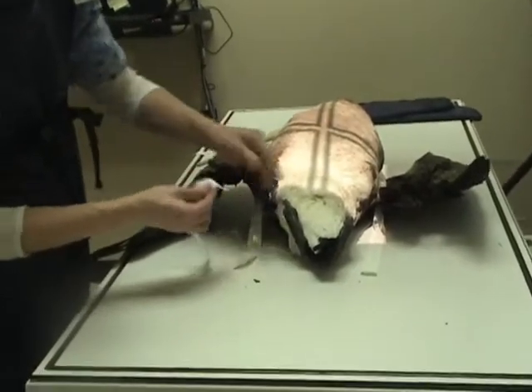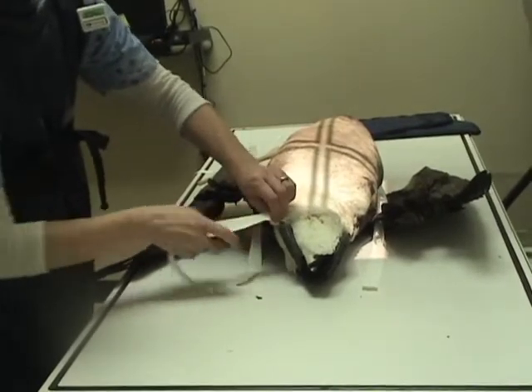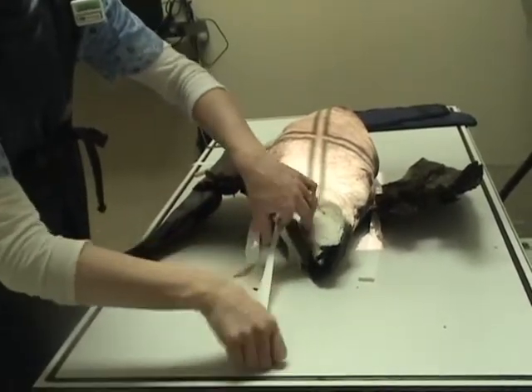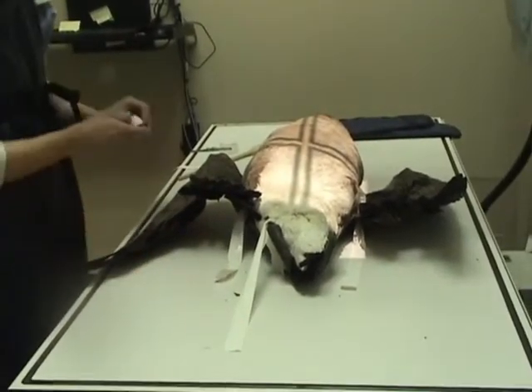The legs were extended caudally as far as possible, positioned as symmetrically as we were able to, and also fastened to the table with tape.